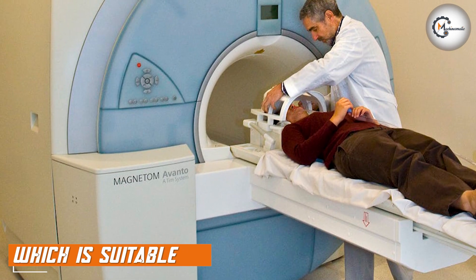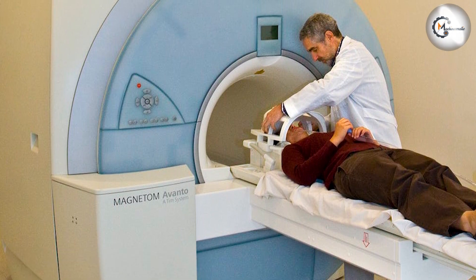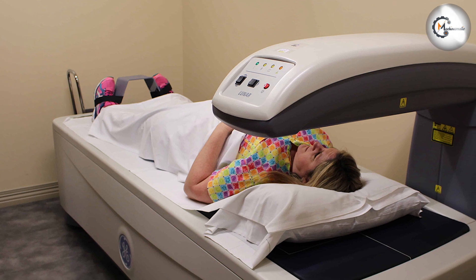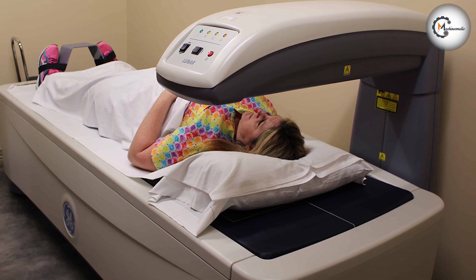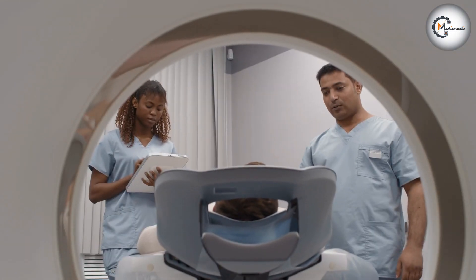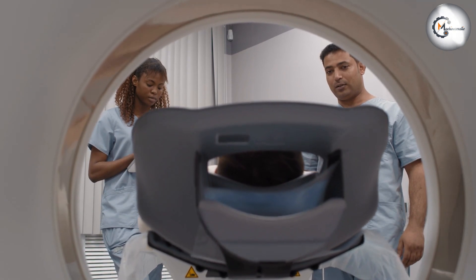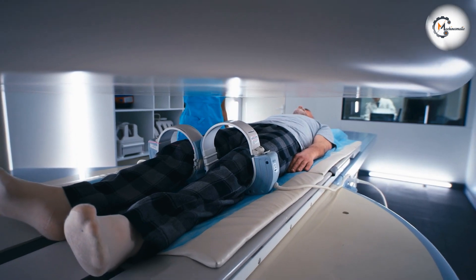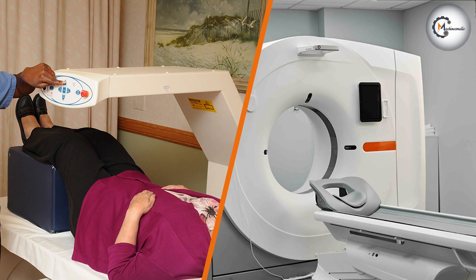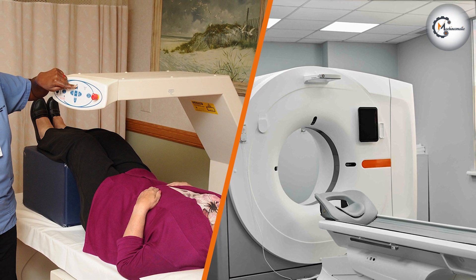Bone scan machine and MRI are both useful imaging tests that are suitable for different bone-related conditions. Bone scan machine is typically used to diagnose conditions such as cancer, infection, and bone injuries. MRI, on the other hand, is commonly used to diagnose fractures, arthritis, and tumors, and is also useful in diagnosing soft tissue injuries. The choice between the two ultimately depends on the condition being diagnosed and the doctor's preference.